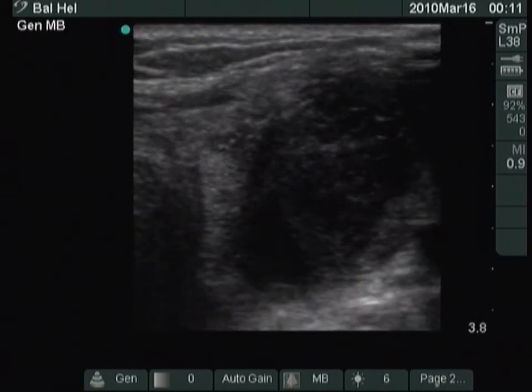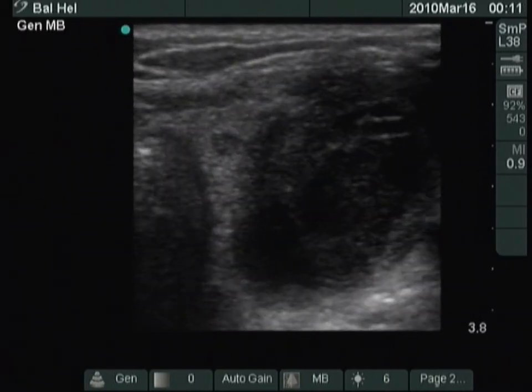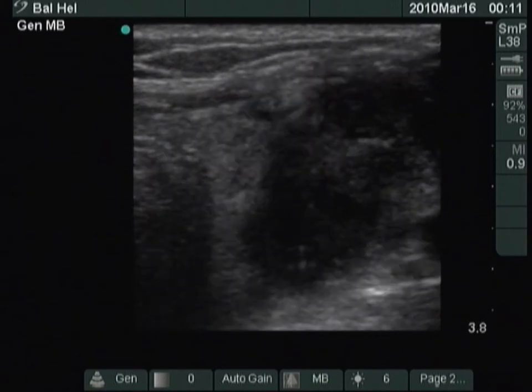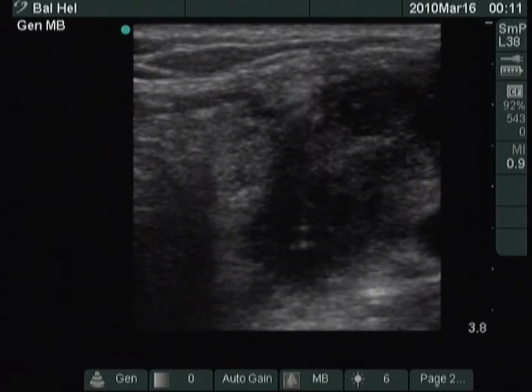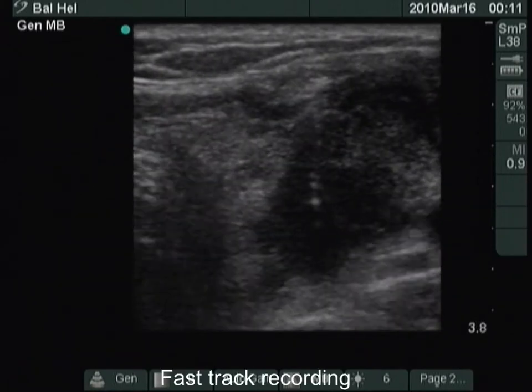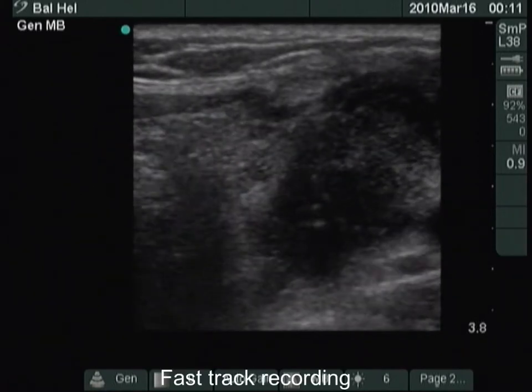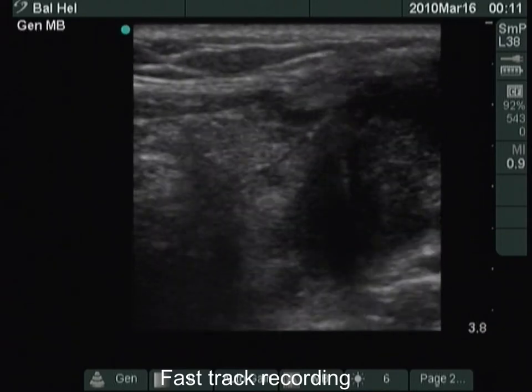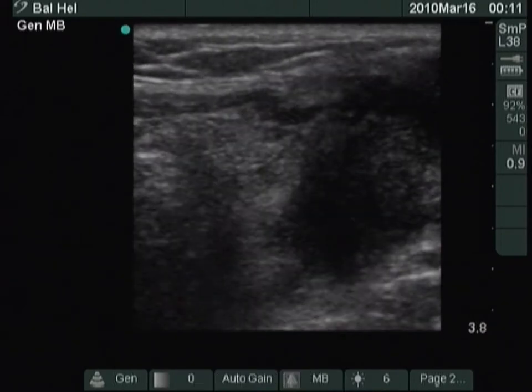First, we place the needle in the middle of the field of vision. The tip of the needle is clearly visible. We aspirate 8 mL of brown fluid.